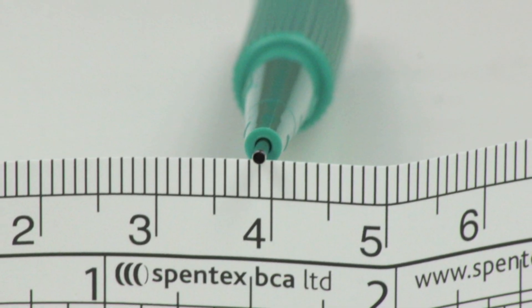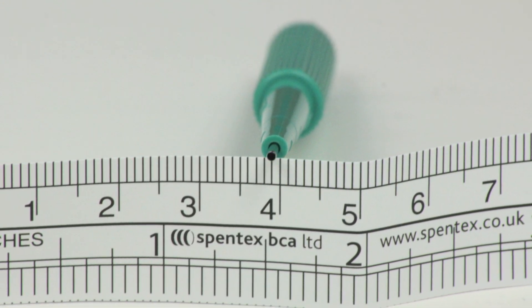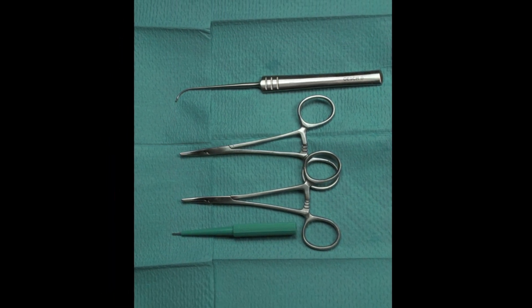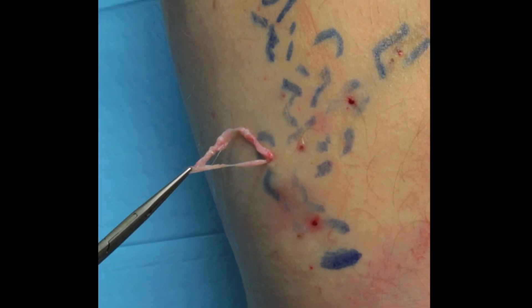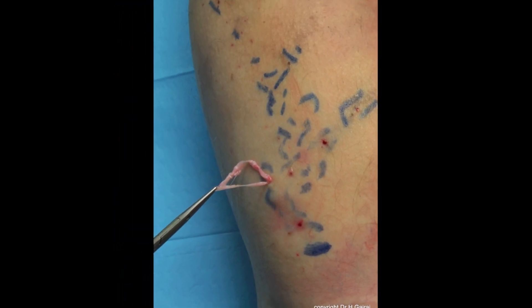Since 2008, I have been using a 1mm circular dermal punch to make a small skin excision. It allows me to introduce my instruments and remove the varicose vein, but unlike a linear incision, when I'm removing a very large varicose vein, the defect will tend to stretch with the natural elasticity of the skin, and once the vein has been removed, the area will recoil back to its normal size again with the natural elasticity of the skin.